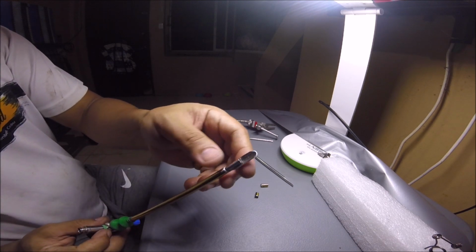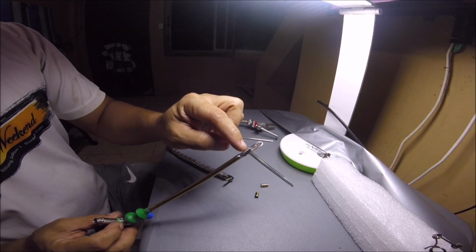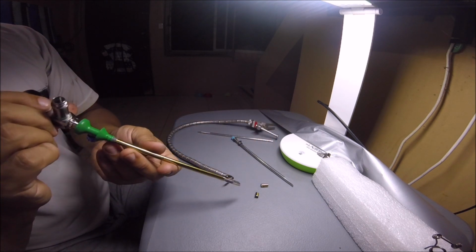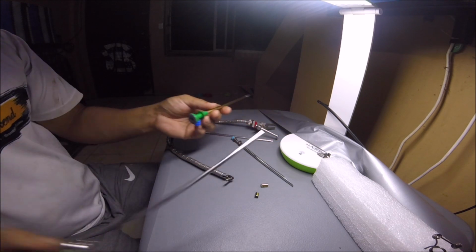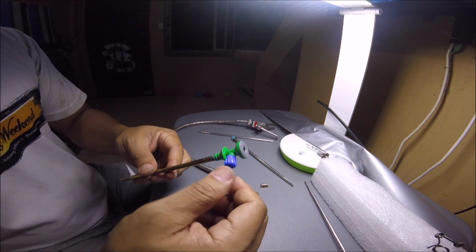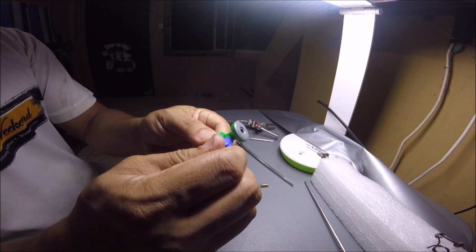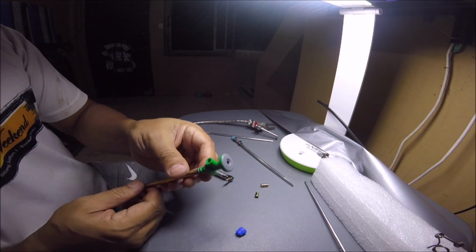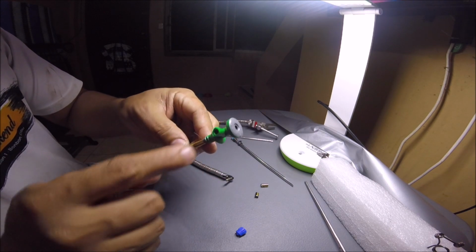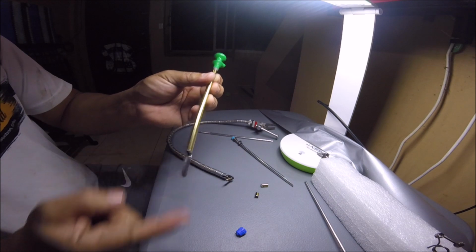Usually when I'm doing the soft tissue work, I can actually bring the scope closer to the bone, to the lamina, and dock it. So I think that will work. Okay, but here's the thing. Before, I used a needle, like a Tuohy needle or a ventricular needle, for my water inlet, my water inflow. Now I have this thing that I built into the tube, and basically I punched a hole in the side of the tubing so that it can accommodate water flow coming from inside there. I can put the saline tube in here, water pops out there.